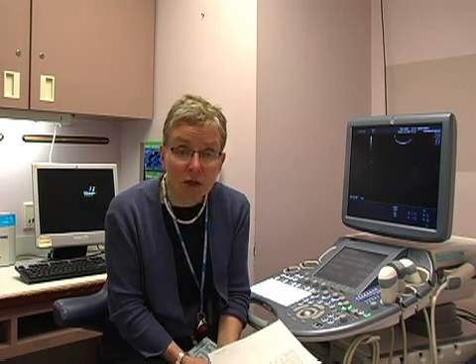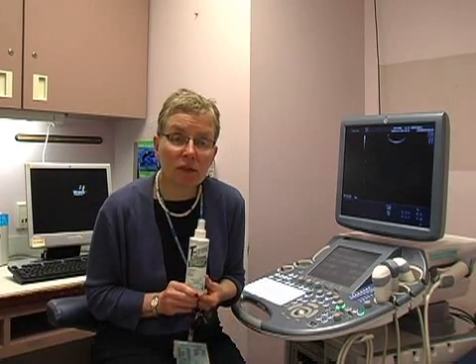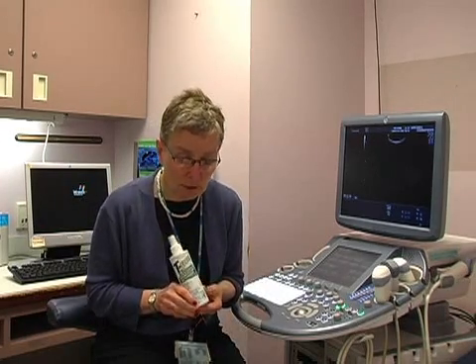The first thing, as with any procedure you do in medicine, is you need to identify that you have the correct patient. Talk to the patient about why he or she is here, confirm your name, and be sure to introduce yourself. As with any procedure in medicine, universal precautions need to be used.